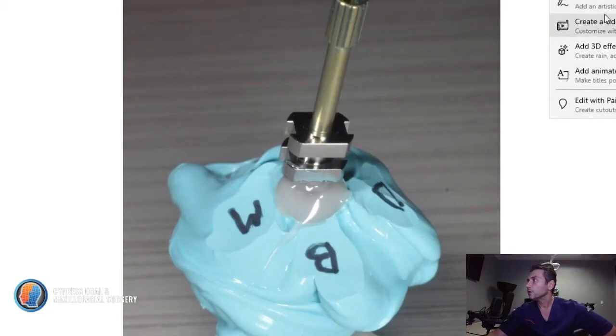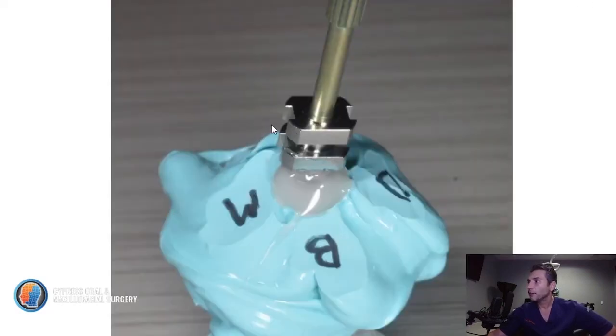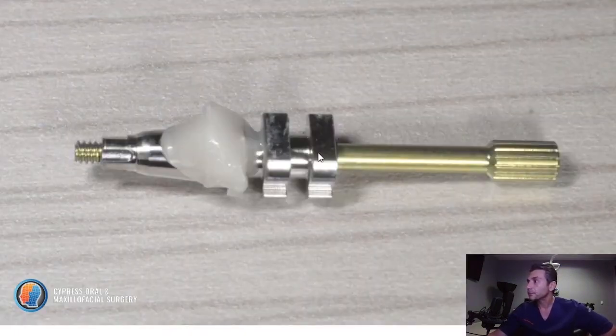If you have any space in the back of it, in this case we don't, but if it's a big central, you definitely will have space there. Fill it 360 degrees all the way around. Sometimes you may want to use a black marker to mark the buccal aspect, because it's easy to get lost when you transfer this to the mouth. When you take it out, that's what the construct looks like.